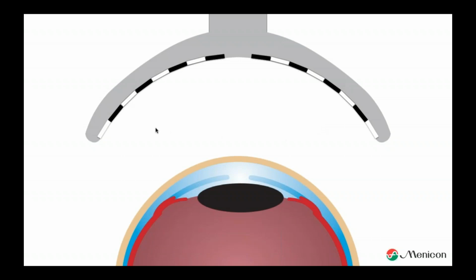Absolutely not true. A topographer is measuring a tangent, because we are measuring a reflective surface, and you can only measure a reflective surface by measuring a tangent. A tangent is just a straight line, and what a topographer is doing is looking for its tangent. Let me explain it a bit better. If you look tomorrow or this afternoon at your own topographer, you will see that it is not a real circle. Every white and black part is a straight line under a different angle.